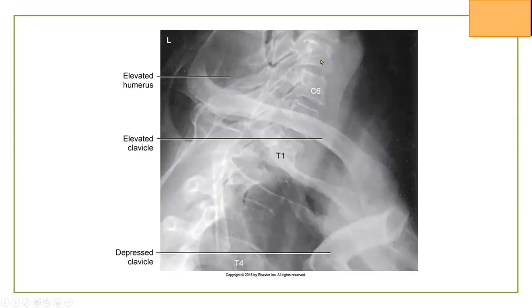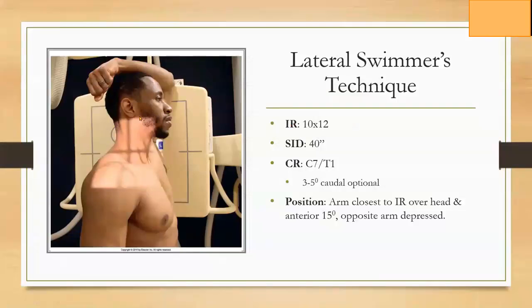It's not documented that this is 5, 4, and we can't see 3, 2, or 1, or maybe somewhere the patient has an extra vertebrae. Going back an image, note how they have it basically at the base of the mastoid tip.